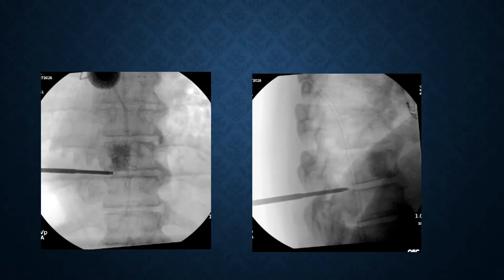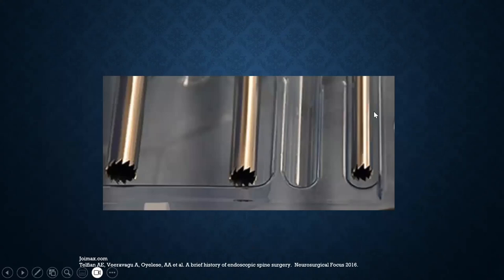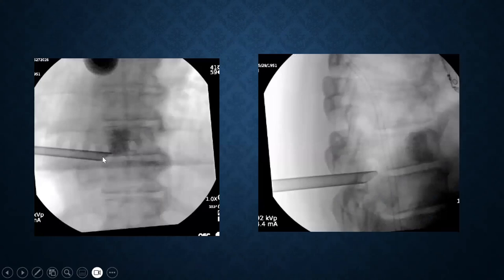So you put the Jamshidi in, you put a K-wire in there, and after you get the K-wire in, you start using your dilators and your different size reamers. The system that I use starts with a smaller reamer, then the middle one, then the big one, and you go through sequentially. Once you've gone through with the largest reamer, you can put your working channel in. You see the working channel here is exactly where we want it to be. It's at the mid-pedicle line, and you're in the foramen. So this is a great place to start doing the procedure.